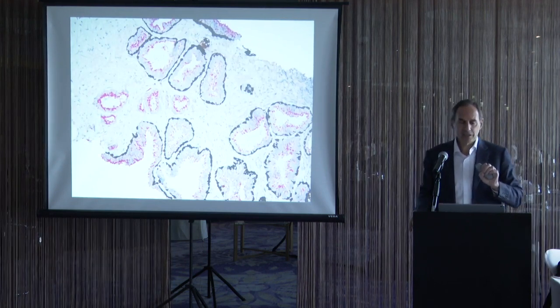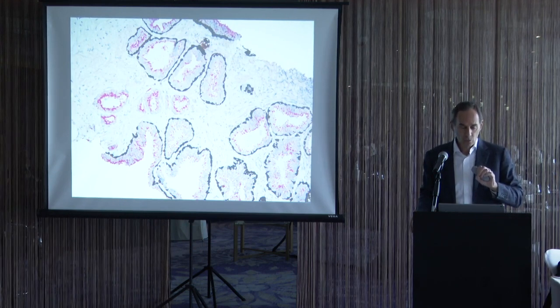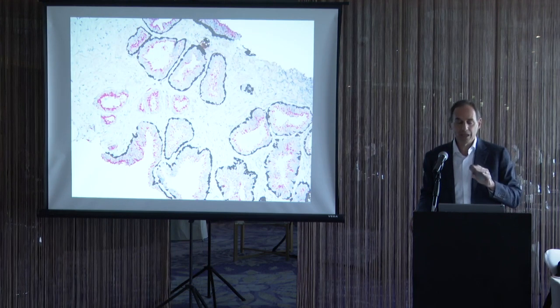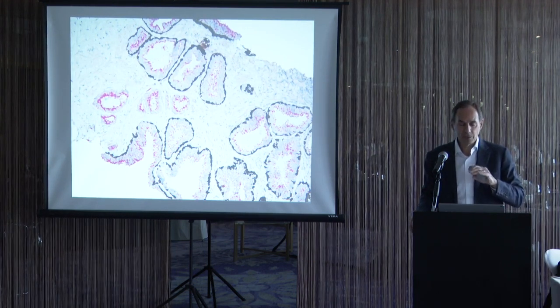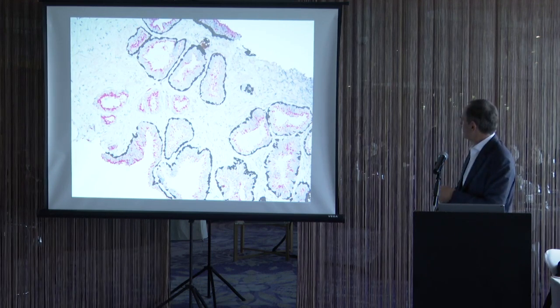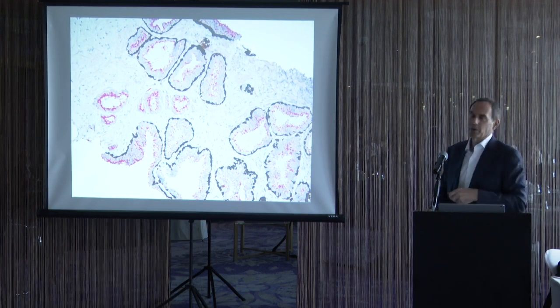Now, in this case, there's another criterion that I use to help me diagnose cancer. The glands here are not that far away from the PIN, and there aren't that many glands, but what enables me to call this cancer in this particular focus is that the high-grade PIN has an intact basal cell layer. All of the high-grade PIN has an intact basal cell layer, so these cannot be outpouchings off a PIN.